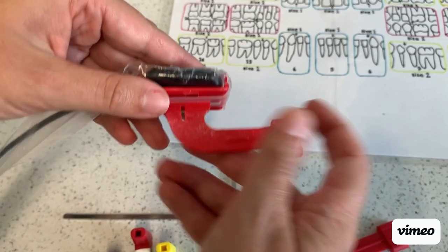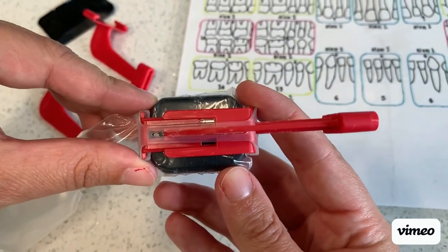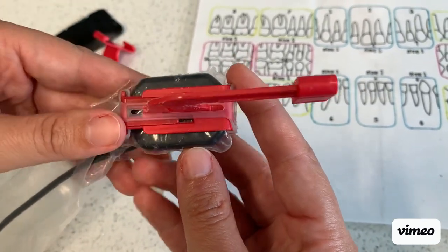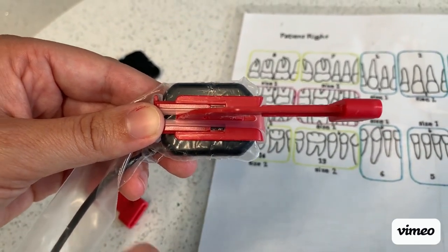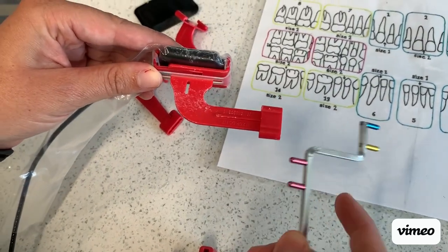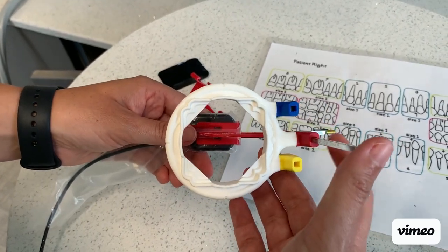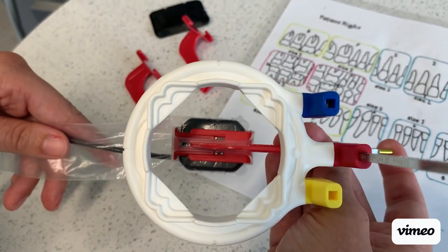Your cord is on the backside, and you want the flat part of the receptor facing the teeth. Make sure the receptor is centered — not too high showing too much maxillary, and not too low showing too much mandibular teeth. Always make sure you're centered and double-check this between every single projection because you might bump it going in or out of the patient's mouth. For the XCP arm, use the red prongs — they slide right into the bite block — then use the red ring. Always double-check that you can see the receptor completely through the circle.